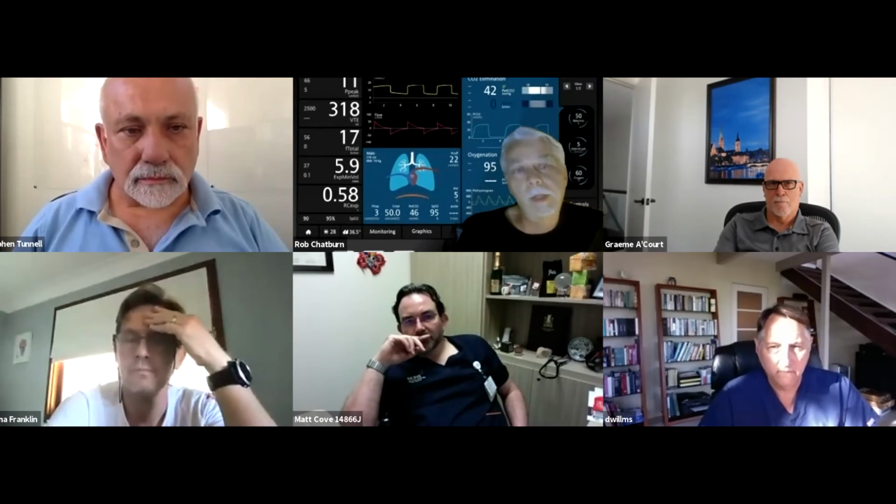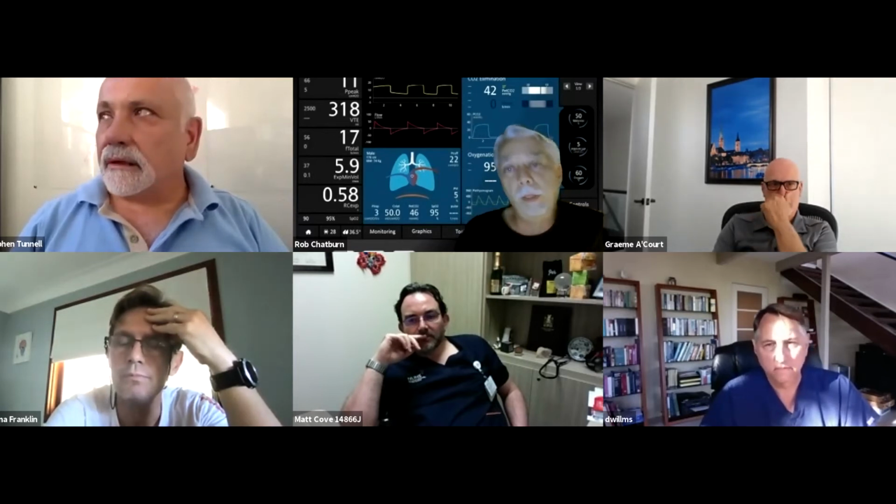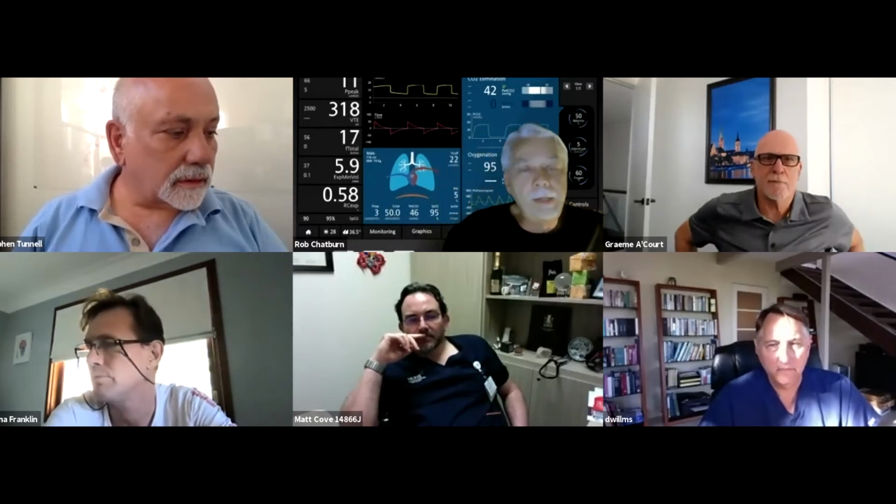Yeah, and it starts to get complicated in terms of the terminology because power is a cumulative index. It's the cumulative work per unit of time, right? Over a minute. Yeah. Or as you might argue, as Marini is now, that there might be another index. Okay, so it's the cumulative time spent at power above some critical threshold. So that would be a cumulative index. And needless to say, these are still in the very early theoretical stages. And they're running these on physical simulators, but we don't even have any animal models to test these theories out.